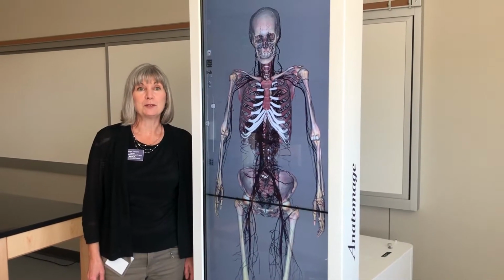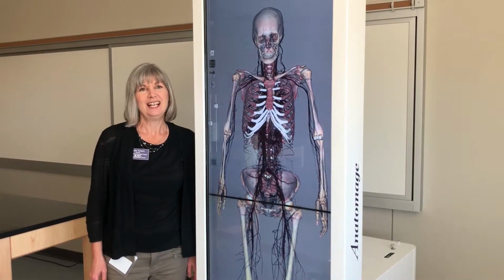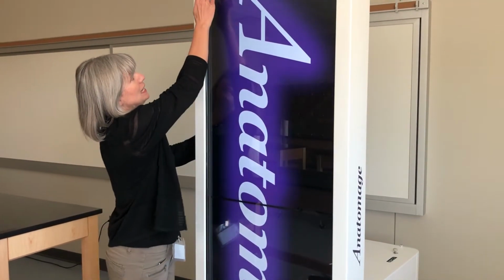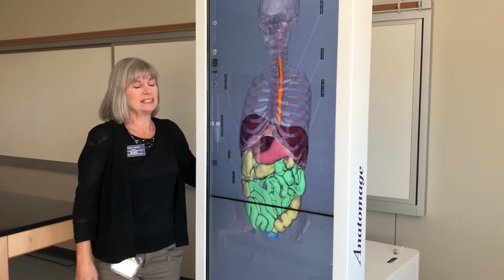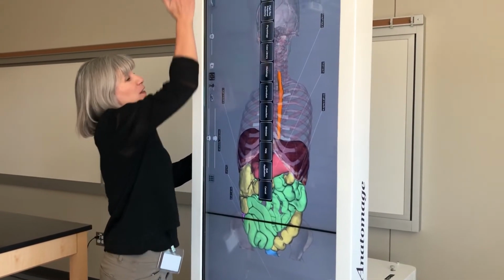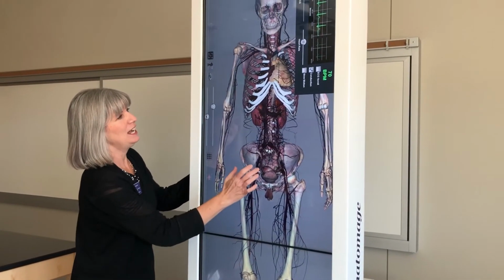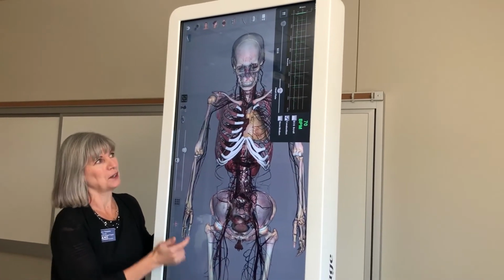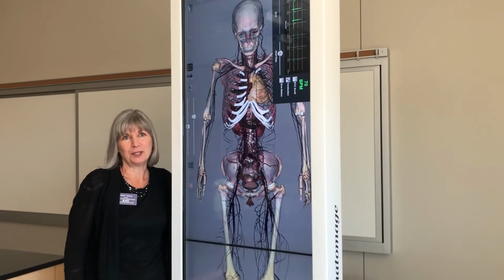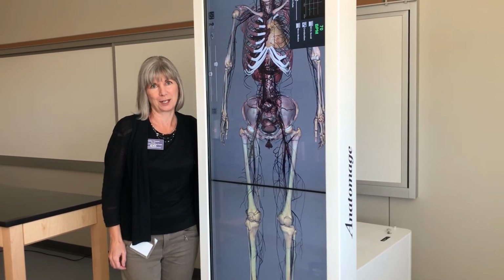The students are able to remove layers to reveal the structures underneath for further study. The students can also highlight different body systems so that they can see their location and the relationship to each other. The table also allows us to study physiology, and you can see the beating heart in this image. The Anatomage Table offers a unique opportunity to study the human body at the Sturm Collaboration Campus.